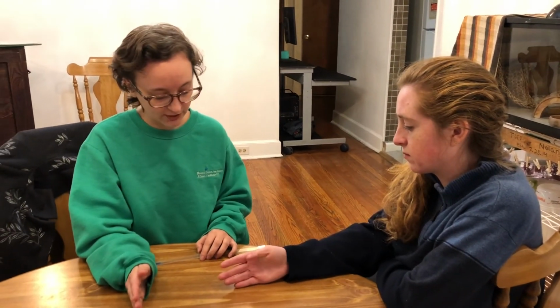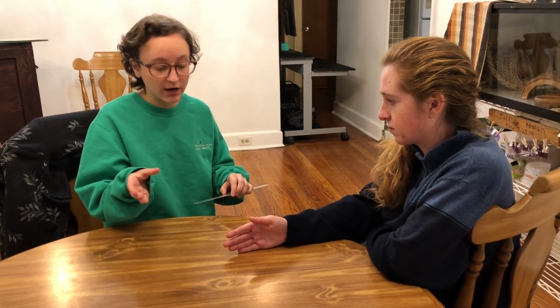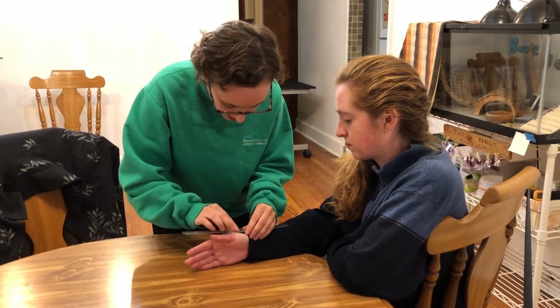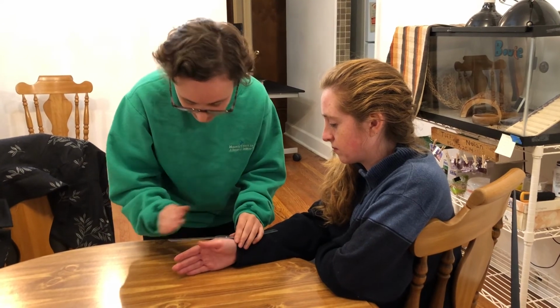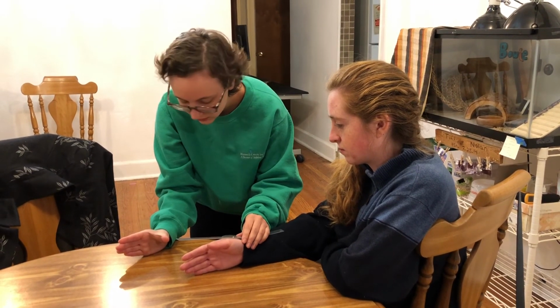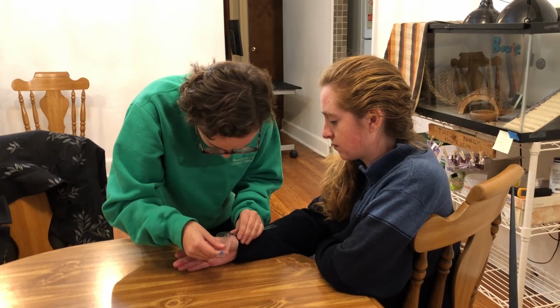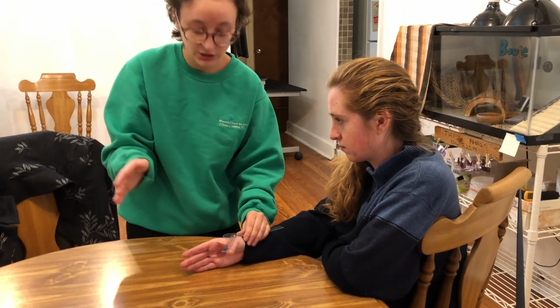So now I'm gonna have your hand up just like this. And this time I'm going to do palmar abduction. So I'm gonna have my fulcrum on the anatomical snuffbox of the thumb, my stationary arm in line with the wrist. And what I'm gonna have you do is bring your thumb out like you're gonna hold a can. Okay, just like that. Okay, and I'm getting 50 degrees for palmar abduction, which is normal.